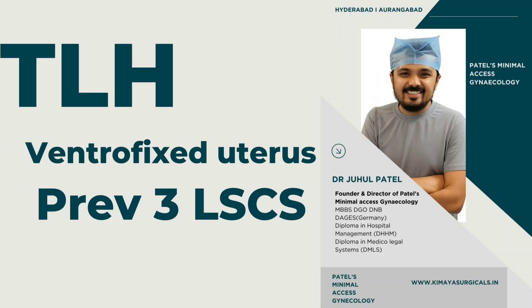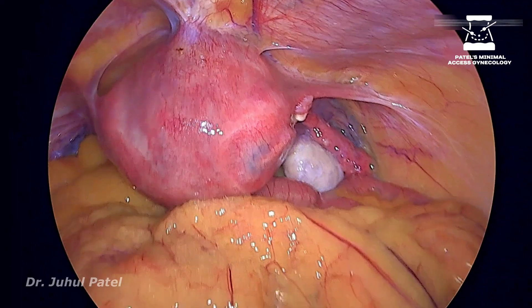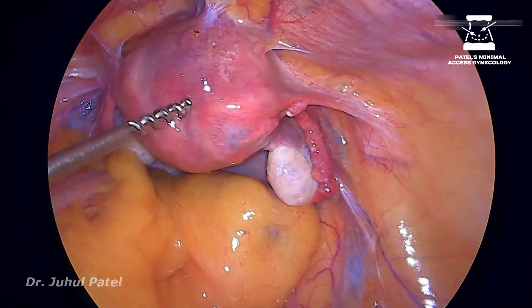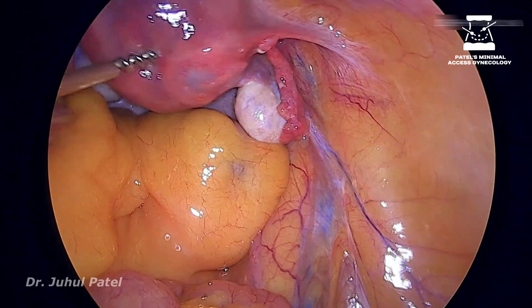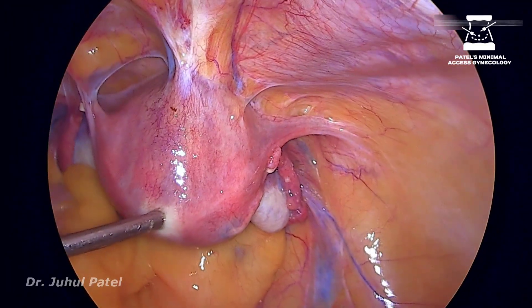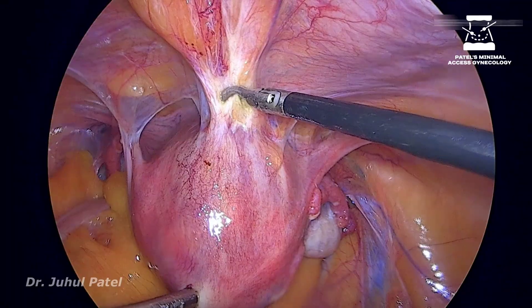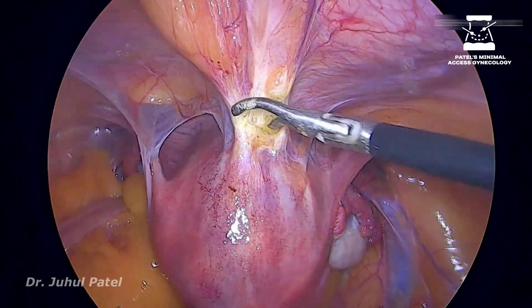Hi, this is Dr. Juhul Patin from Patel's Minimal Access Gynecology. This case involved a previous three LSCS and as you can see, this is a ventrofix uterus. In cases of ventrofix uterus, I feel all of you should have proper surgical anatomical knowledge of the space of Retzius.